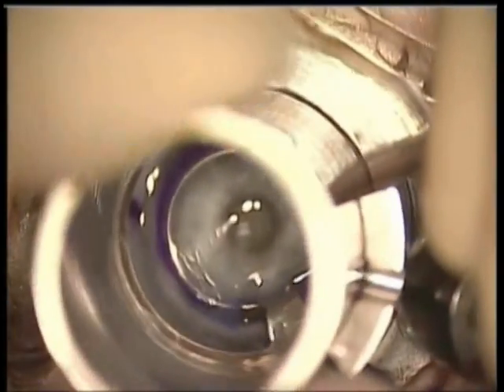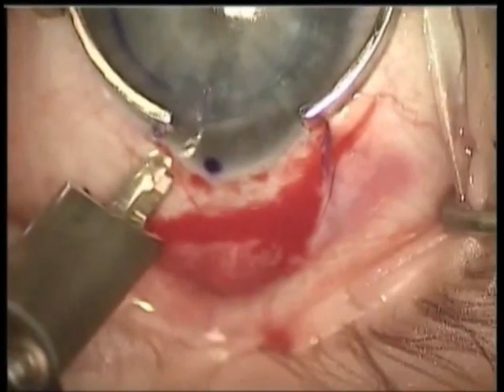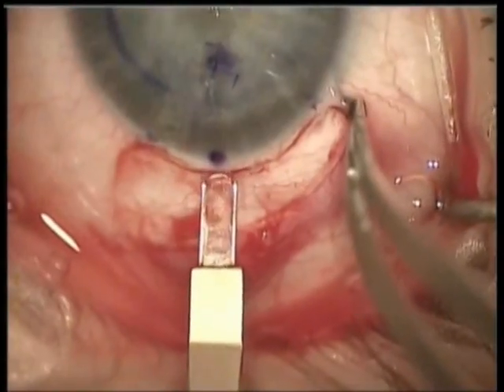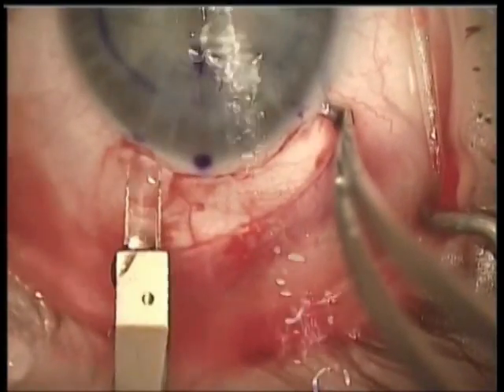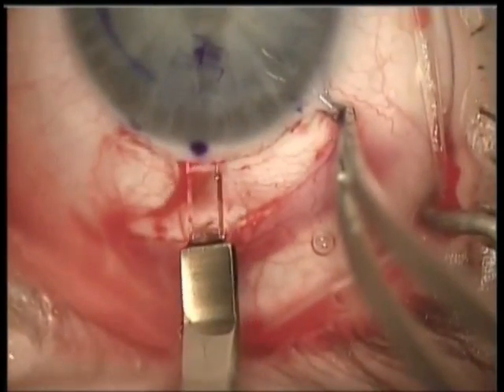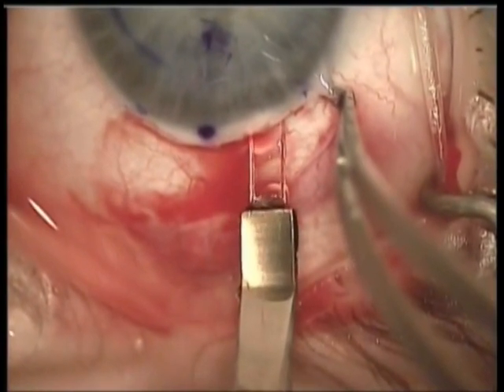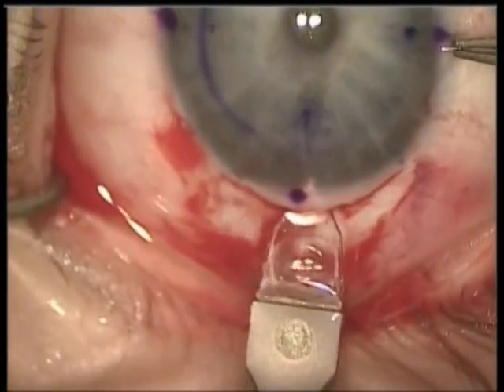The vacuum centering guide guides this entire process. The vacuum is released, and then attention is turned towards the Verisyse lens implantation. A temporal 6 mm scleral tunnel is created, and a keratome is used to enter the anterior chamber.